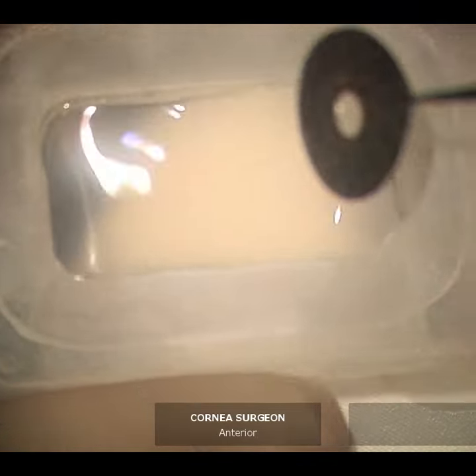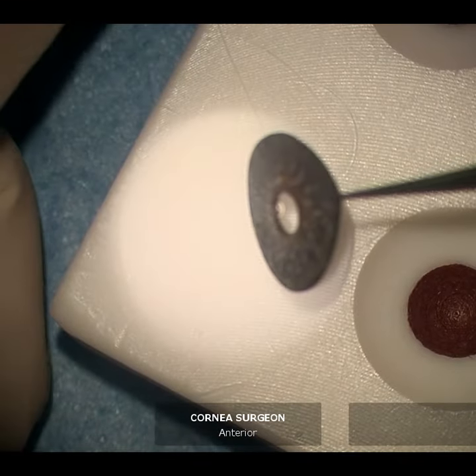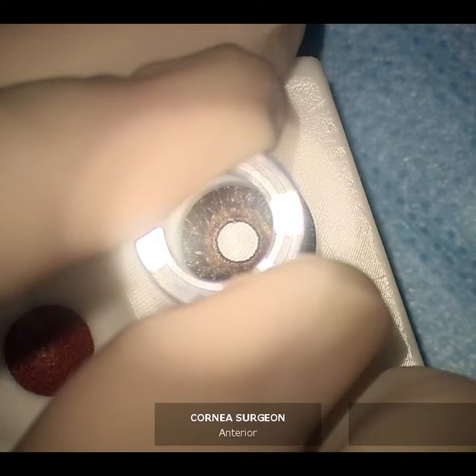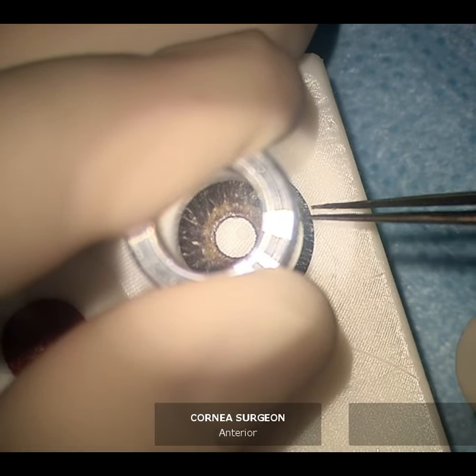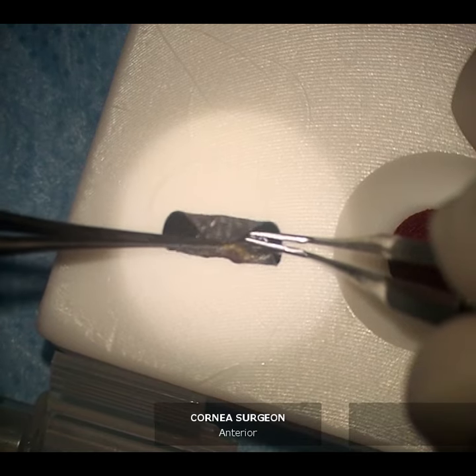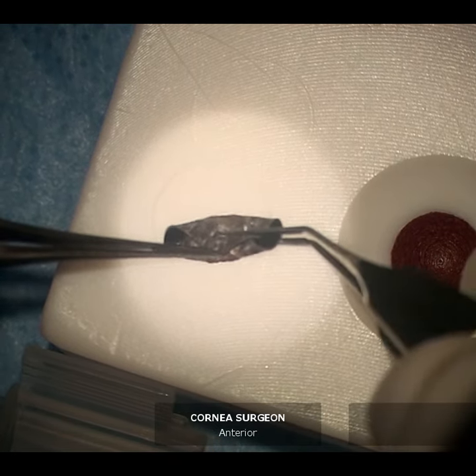The artificial iris was color matched to the other eye, the size was measured and the implant was trephined to the correct size. The implant was then folded and placed into an injector.